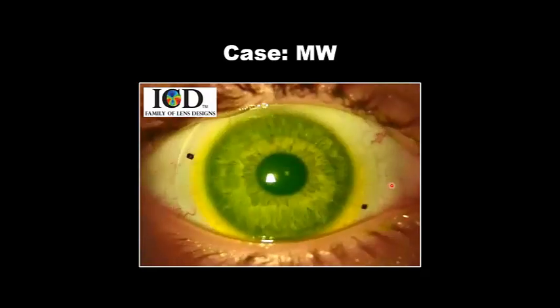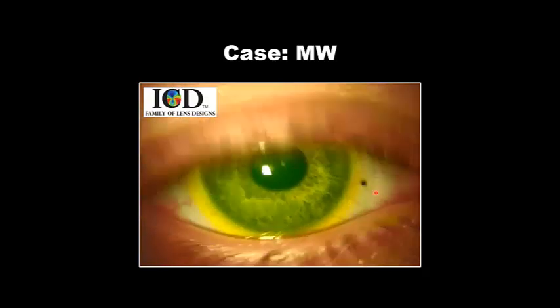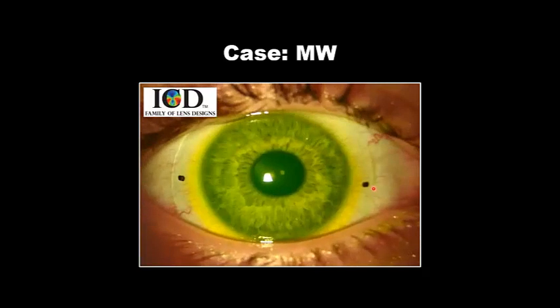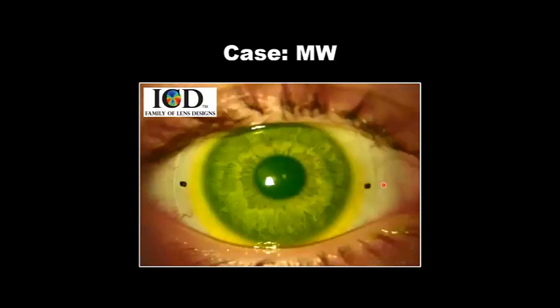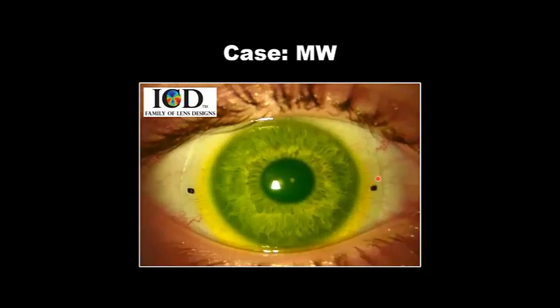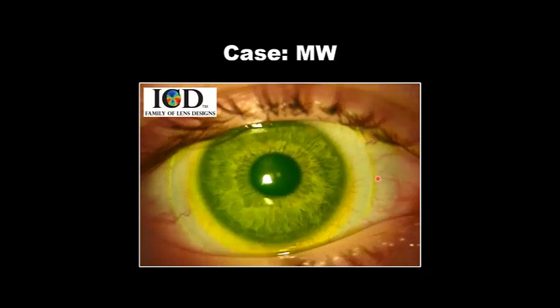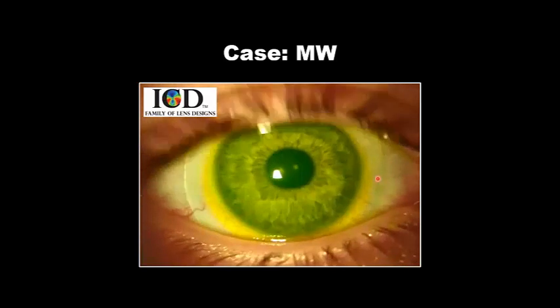What you want to communicate to Cardinal Contact Lens is, where do these markers find rotational stability? Is it 0, 180? Is it 45 and 225? Where is it exactly? Then when your custom order comes in, it should sit at exactly the same axes as the trial lens. So again, these markers are not meant to be at 0 and 180. They're meant to denote the flattest meridian of the lens, and they should find the flattest meridian of the sclera. Now, if your lens is rotationally stable, then you can imagine we can place a front toric power into the contact lens, and any residual astigmatism is addressed.